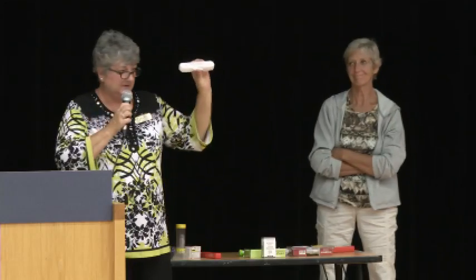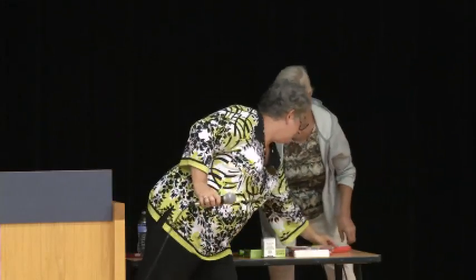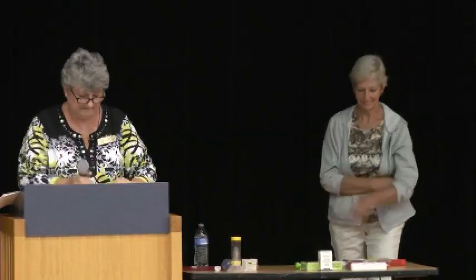So when you go into your sessions for the return demonstration, you're going to be working with trainers in these white kits. I don't think the trainers very accurately give you an idea of what the glucagon looks like. So although you're going to do the return demo with this, you're also going to have an opportunity to see what a real glucagon looks like, and they're in the red kits, and there's a couple of these in each classroom for you to look at. The kits have step-by-step directions in the lid for you to have quick reference. Remember, in the red folders, there's also a sheet of a quick reference guide for you to review.